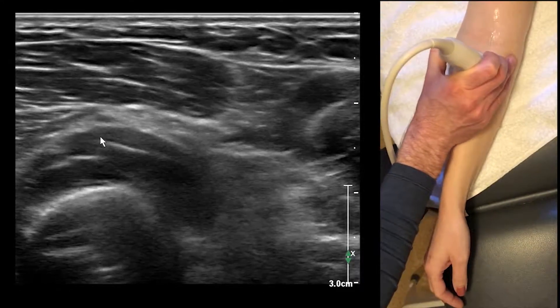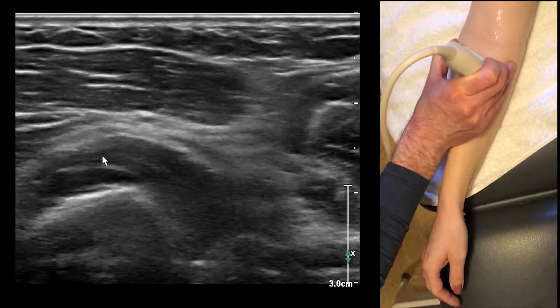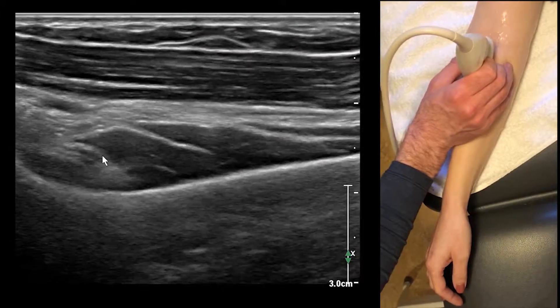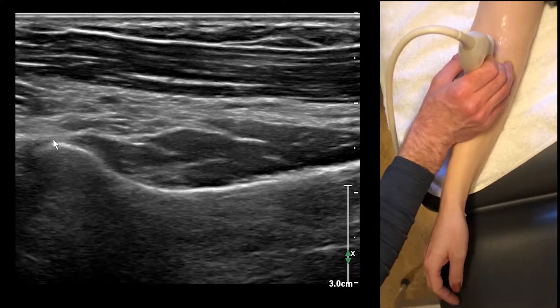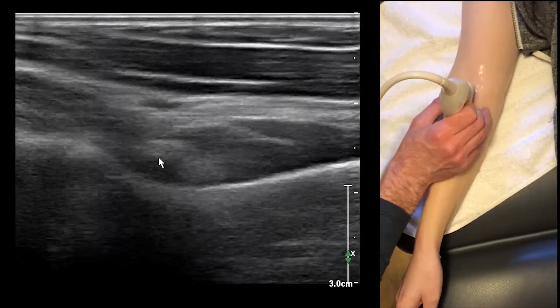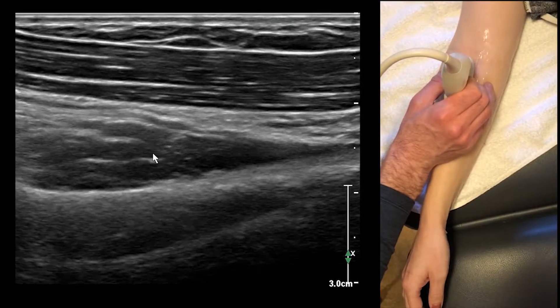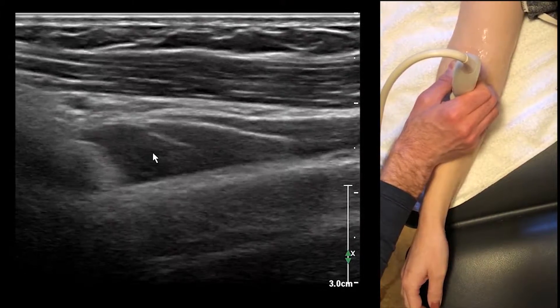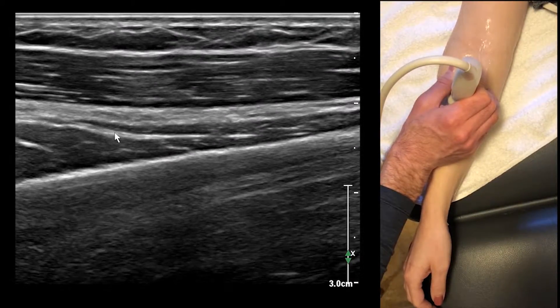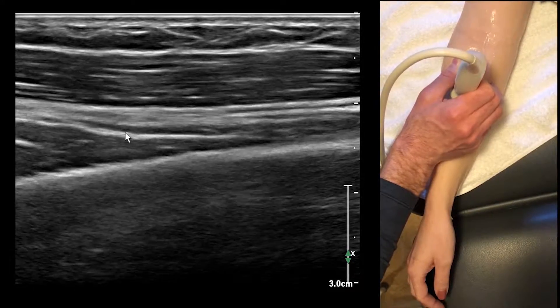The deep branch is a little more difficult to follow. Here is the supinator — first I'm going to go on long axis on the supinator just so you can see it. This is the radial head here, this is the supinator right here. And this little fascial plane here is where the posterior interosseous nerve is going to run.